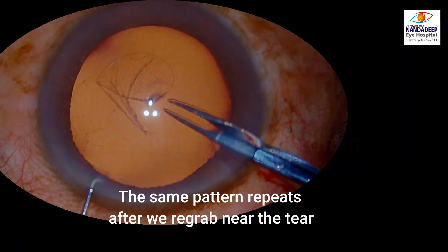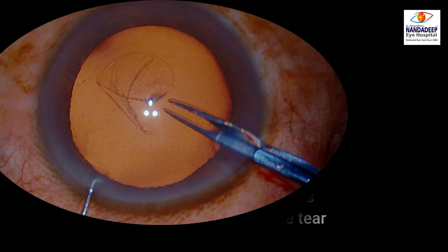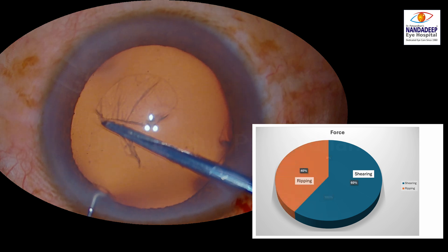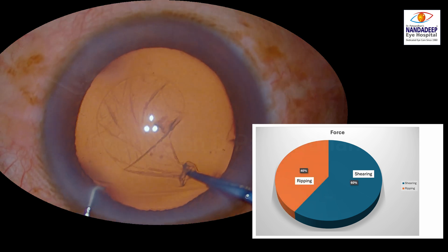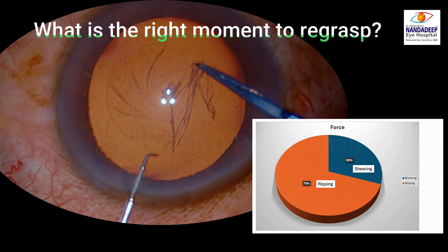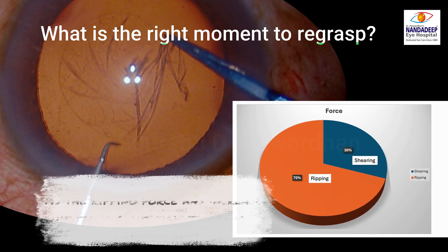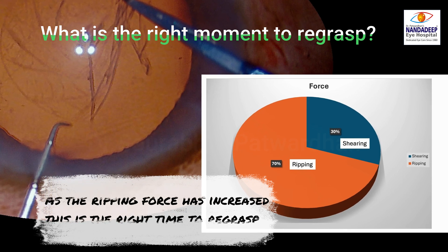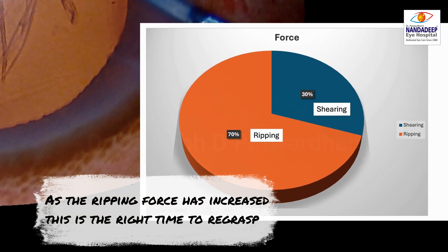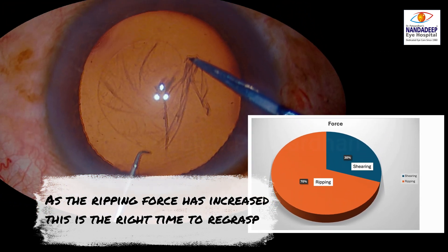The same pattern will repeat when we re-grab the tear near the edge. Initially it will be 100% shearing, but as you keep pulling, the percentage of ripping becomes more and more. So what is the right moment to re-grasp? As the ripping force increases and becomes more than the shearing force, this is the right time to re-grasp — and you can watch this pattern to identify that right point.